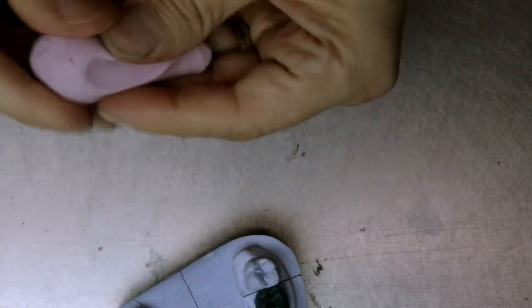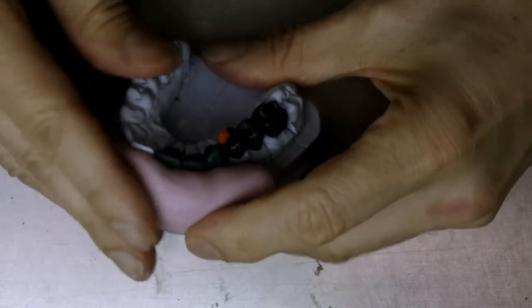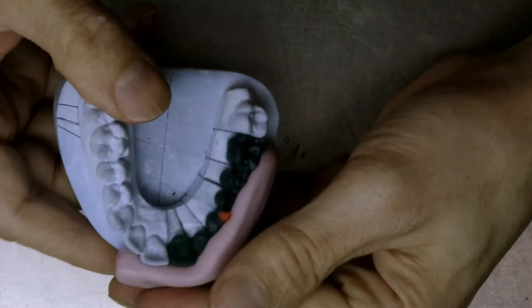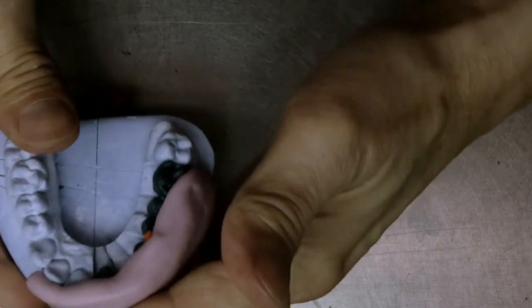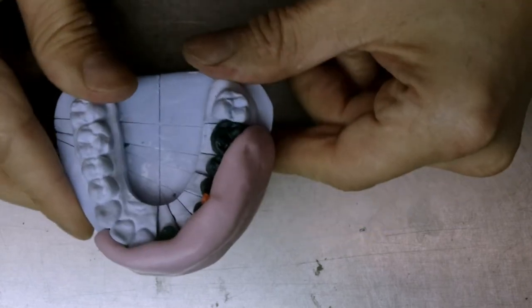So now there are no lines on it, and we make a little bit of a worm shape. And then we place it on the labial surface, and then just cover the incisal area, just like that. And then we let it set.